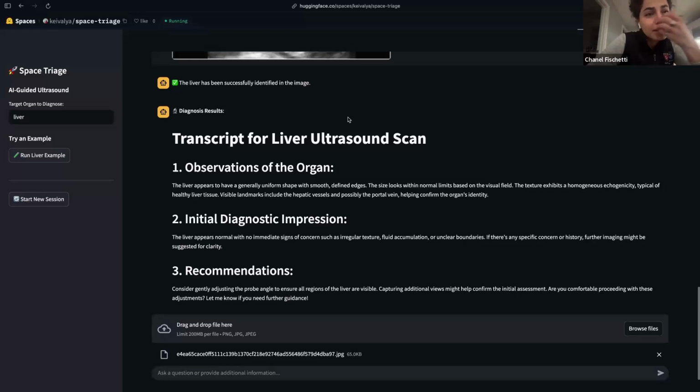But I love this because this is a real life problem. Point of care ultrasound is currently the only diagnostic and therapeutic modality in space. Portable MRIs and X-rays are being developed, but ultrasound is the only one without radiation, which, especially in space, is a big issue too.